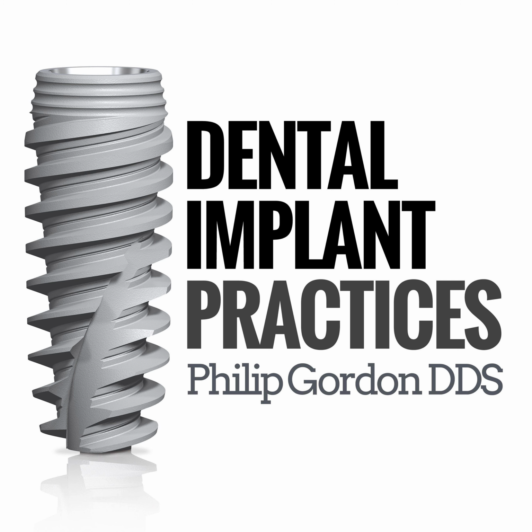Once it's anchored, you remove what we call the monostrut, which is basically a clear version of the patient's prosthesis, and check the occlusion too. Then remove that portion of the bone foundation guide, because it's two pieces, and level your bone to the level of the bone foundation guide, which is what we planned at our virtual consultation.